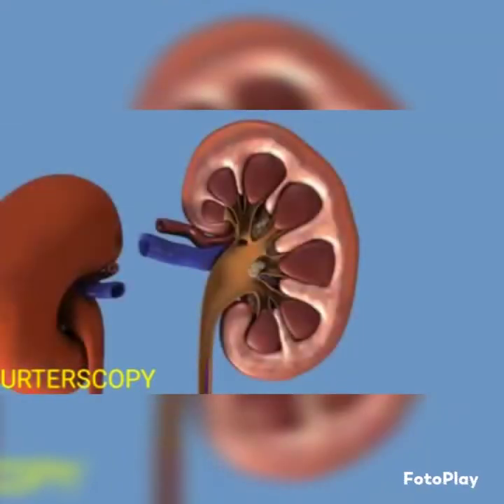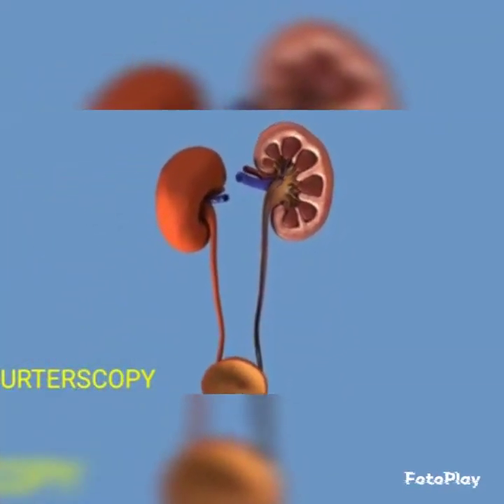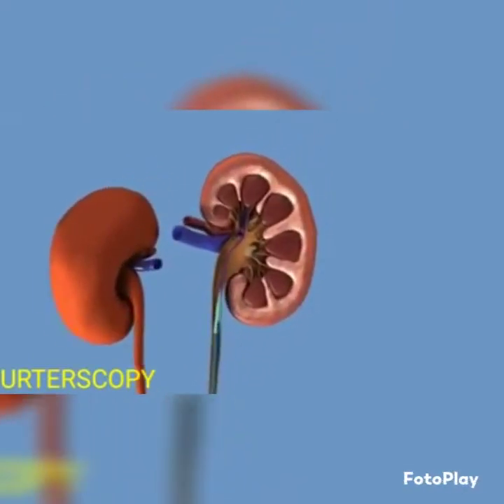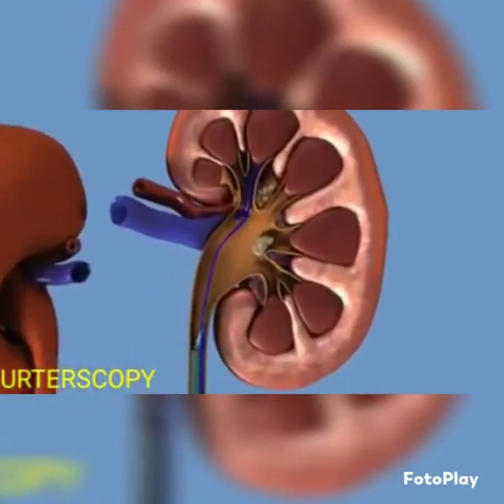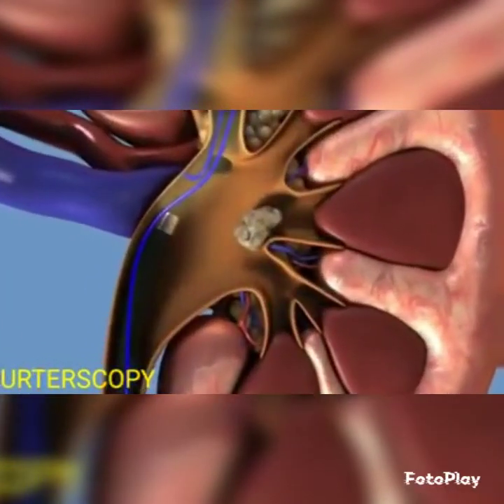A so-called safety wire that helps guide the ureteroscope through the ureter is inserted. Depending on the location of the stone, a rigid or flexible ureteroscope is passed through the urethra into the bladder, following the safety wire into the ureter, the small tube that drains urine from the kidney to the bladder.